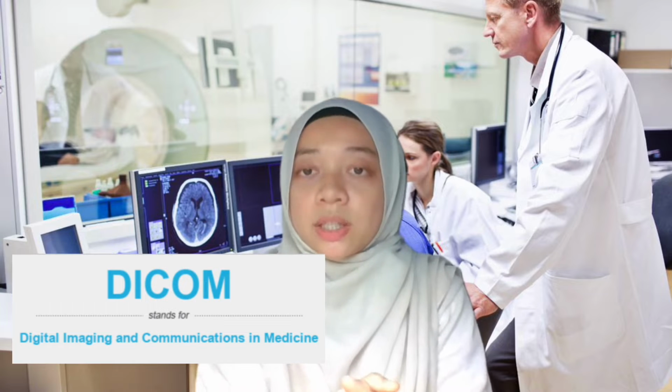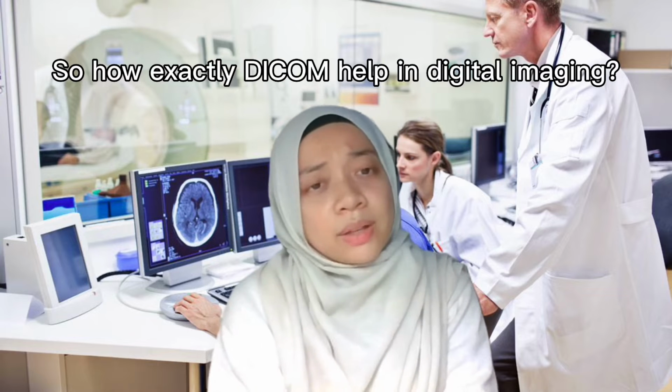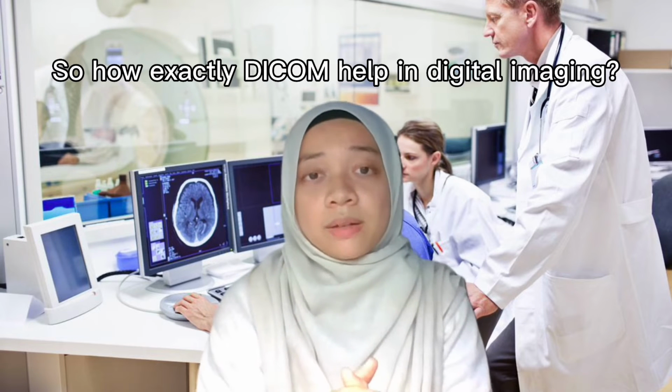Talking about standardization, Dicom is also one of the software. Dicom stands for Digital Imaging and Communication in Medicine. Through the name itself, we can know that this software is specifically for digital imaging. So, how exactly does Dicom help in digital imaging? Dicom is actually a format for medical imaging. The basic definition for Dicom, according to the TechTarget website, a website with experts in technology and software: Dicom is a standard protocol for the management and transmission of medical images and related data and is used in many healthcare facilities.